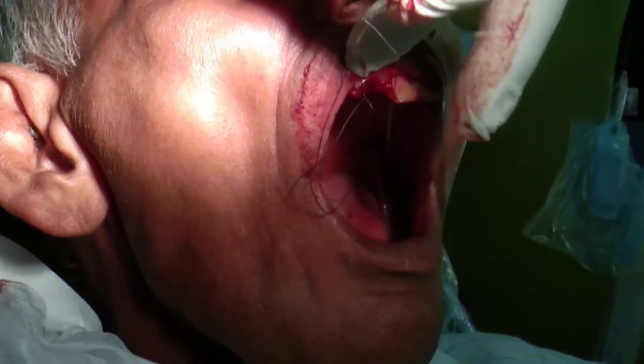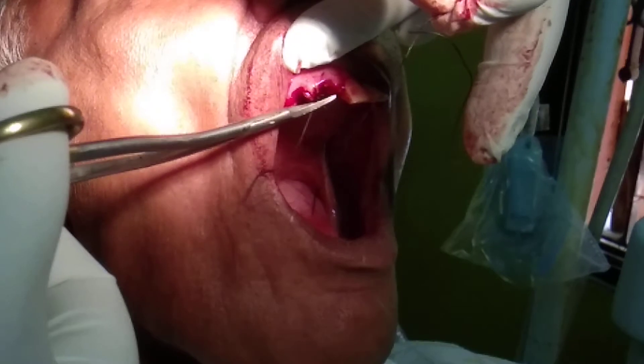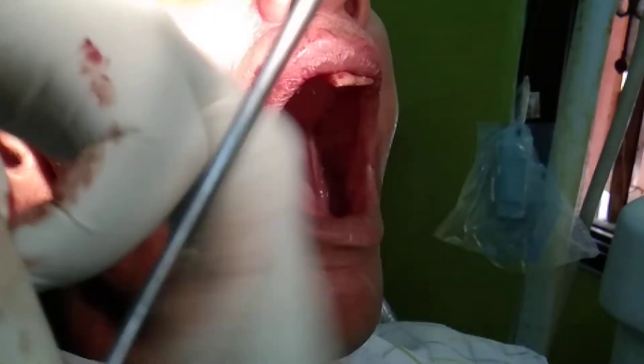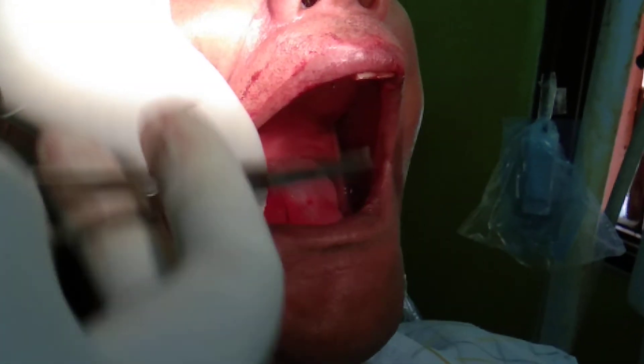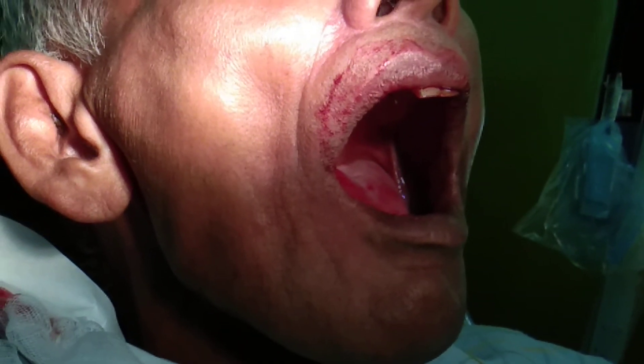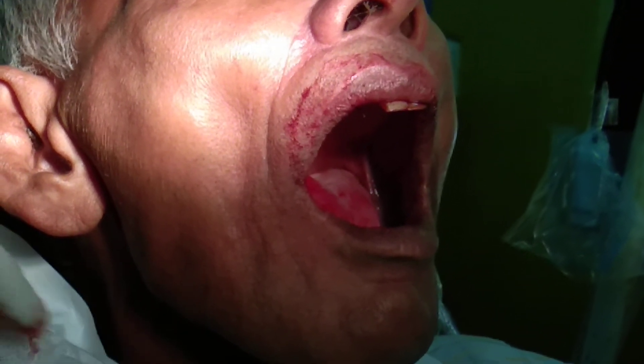So now, with the scissor, I am going to cut this suture. And I am going to ask the patient to take a 4x4 gauze and ask the patient to bite on it.